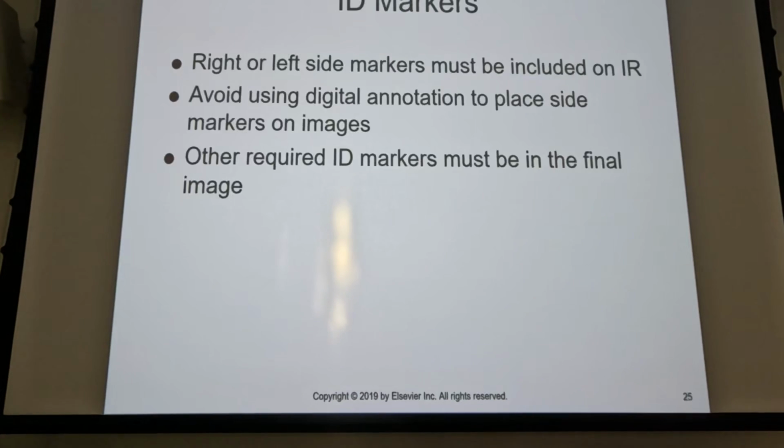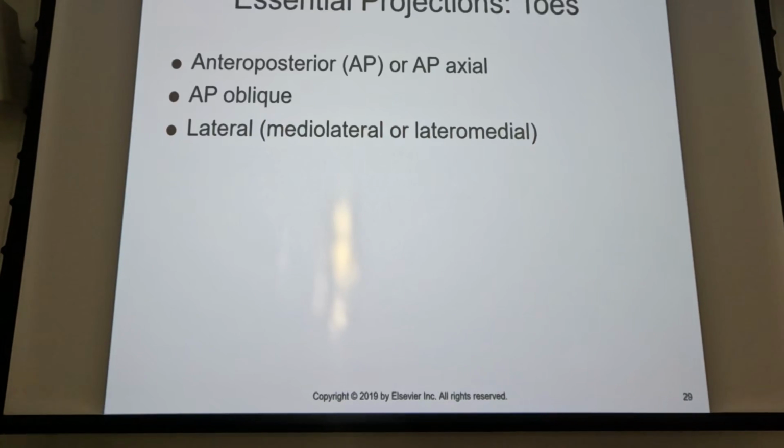All right, SID again is going to be 40 inches, markers, all that stuff. All right, so toes. We're going to do 3 view of toes. Sometimes you'll have an order for 2 view toes, and that's just going to be an AP and a lateral.